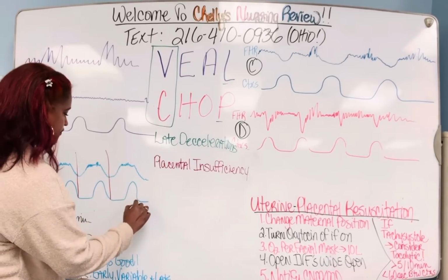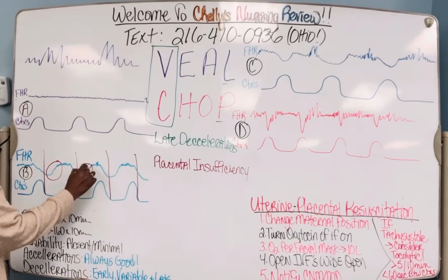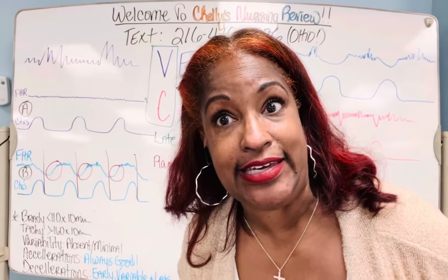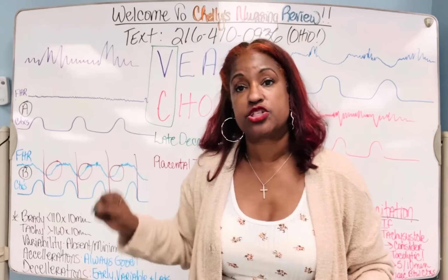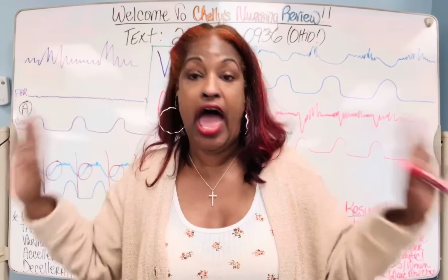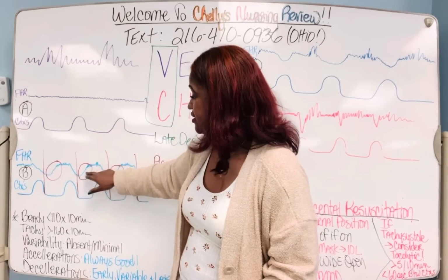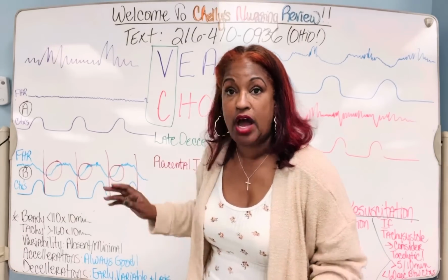And if you keep doing that, you'll see that this fetal heart rate is still low. It's still down. In other words, it's returning late. Yes, it started going down, and even after the contraction was over, which is when the baby should have recovered, it did not recover at all. It was a late recovery, late decelerations. It stayed down for quite a while.